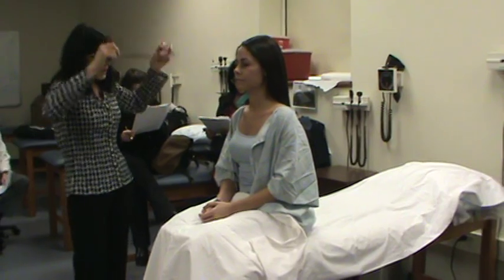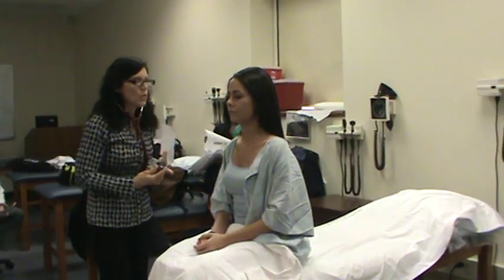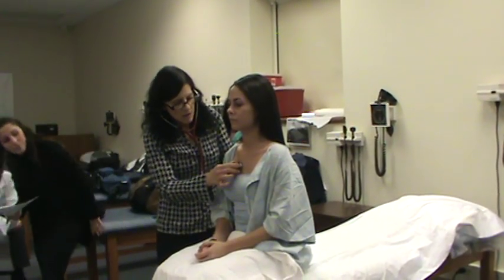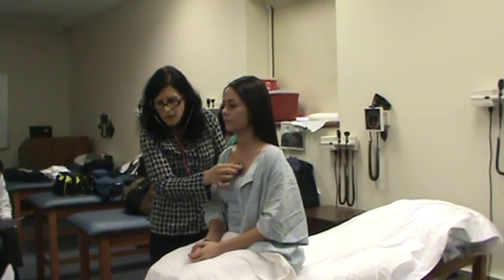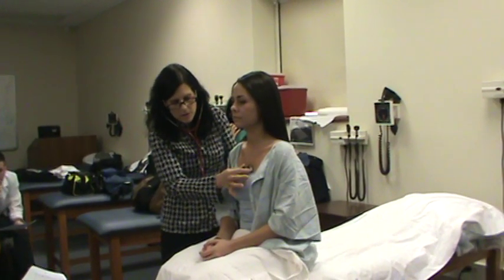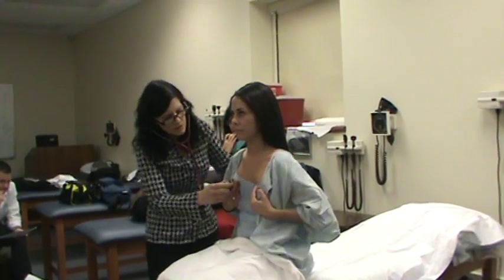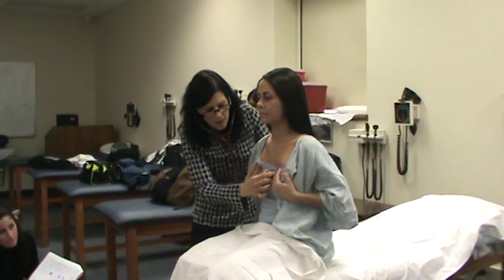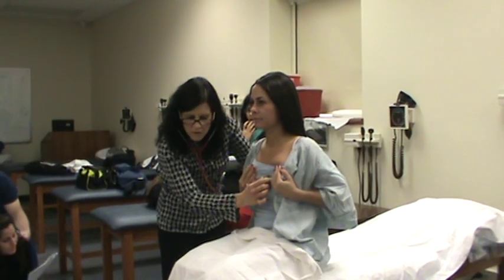Now I'm going to listen to your heart. I'm going to start up in the right second intercostal space so I can listen to the aortic area. I'm going to test to make sure I'm listening with my diaphragm. Then the left second intercostal space for pulmonic. Third for Erb's. Can I ask you to move your breasts? Fourth intercostal space for tricuspid. And then right about in the mid-clavicular line for the mitral.